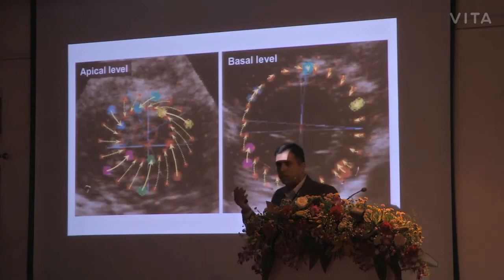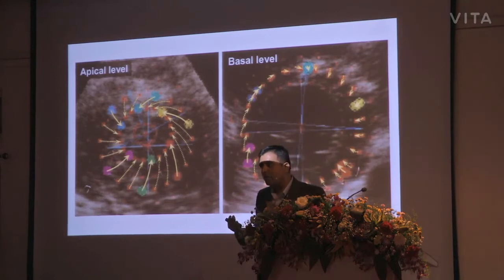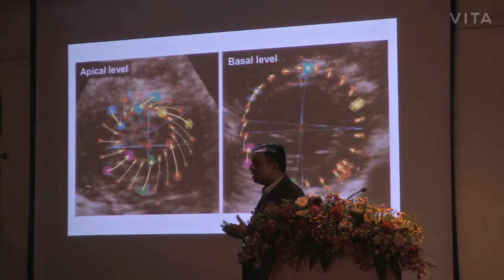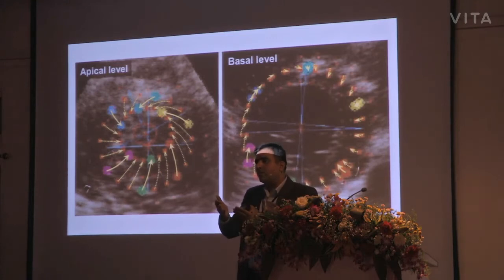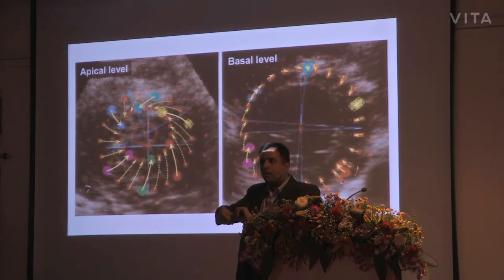The torsion, or the rotational motion of the heart, we are able to see from the apex at very high frame rates. And surprisingly, I am always surprised at the beauty of our heart. Say if I was to give you a cloth full of water, how do I dry it out? I would twist it. Okay. That is the most efficient way of getting water out of that cloth. Not this way, not any other way.